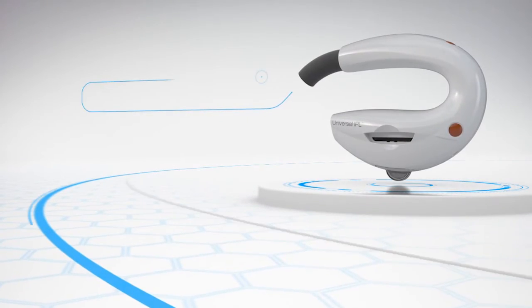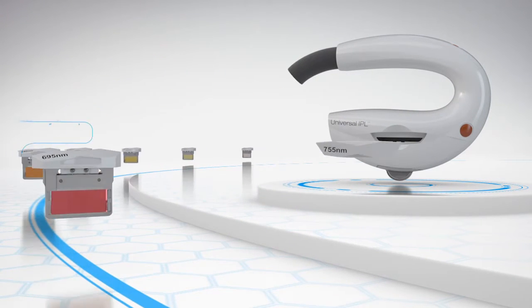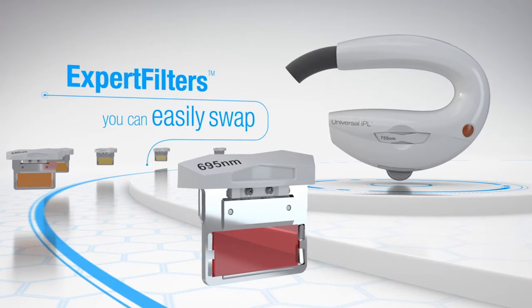By having these different filters, we're able to treat almost everybody. One of the wonderful things about the filters is that they're lodged in the device. All you need to do is pull out the filter, put it into your handpiece, and you're ready to treat the patient.